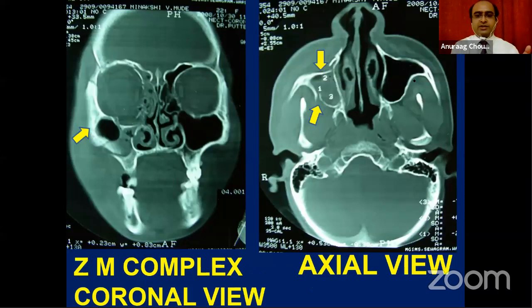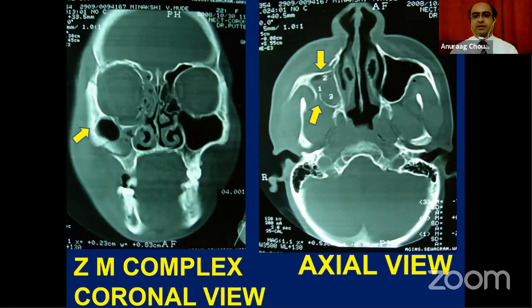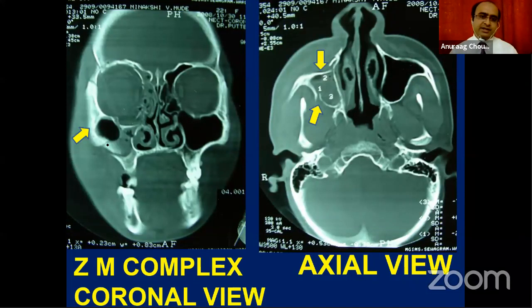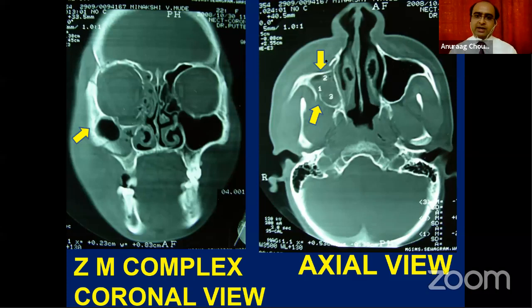These are real patients gathered over 10 years of imaging practice since my post-graduation, presented at many conferences. This patient has a zygomaticomaxillary complex fracture. In the coronal section, you can see the fracture lines and alteration in sinus anatomy. In the axial image, the anterolateral wall, and posterior lateral wall of the sinus can be seen, with markings 1, 2, and 3 given by the radiologist.